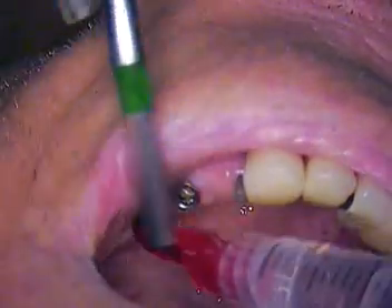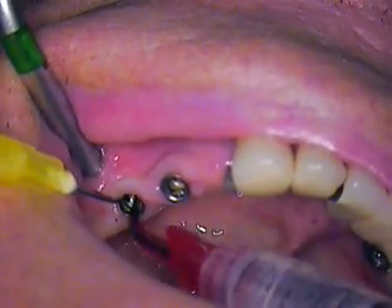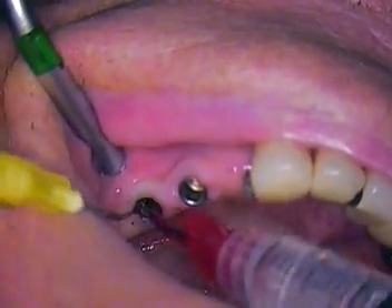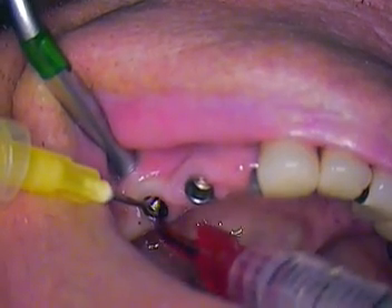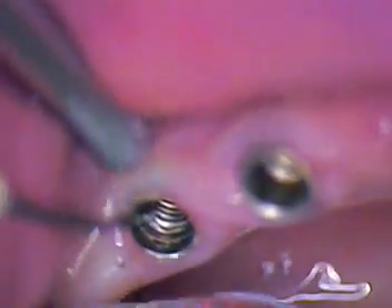Backed it out — it didn't take very long, so it'll save you some time on your next visit. You can see it's reflecting a lot more light on that number 19 because the plastic covered the threads, so there's no debris. I may have a couple of protective caps that I can maybe fit in there today to keep bacteria from getting in there.